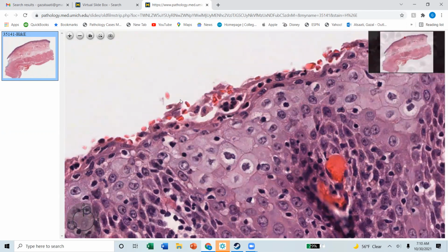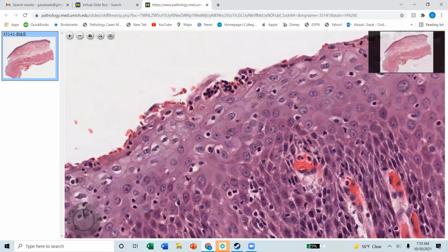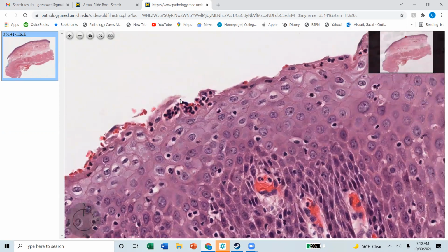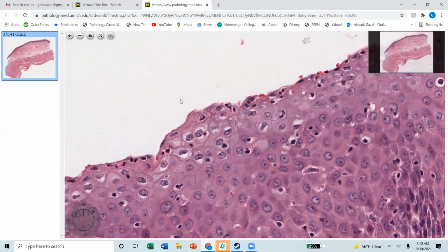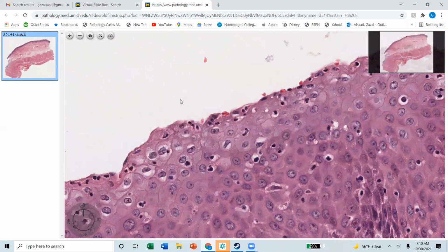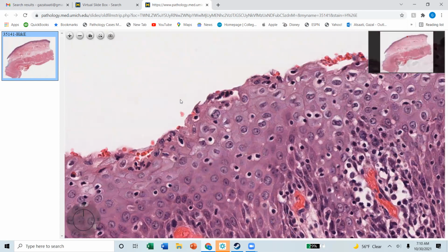Another thing that I will do here is definitely fungal stains, because with achalasia there will be a lot of spasm, and it's a good environment for fungus to stick. It's not relaxing, and the food will be stuck.